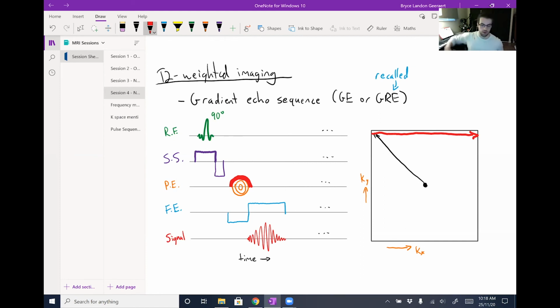Now, I don't know if you've checked in your time working with MRI images, but typically a resolution of MRI images is somewhere between 64 by 64 pixels for a given slice, or 128 by 128, or 256 by 256. That I would say is probably the most common, 256. But what that means is that we need the same number of rows and columns in our k-space to produce an image of that size.